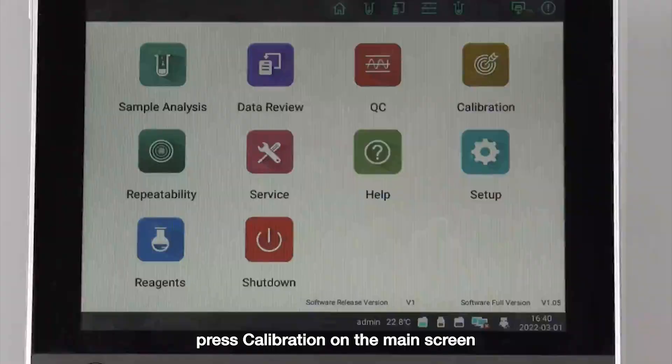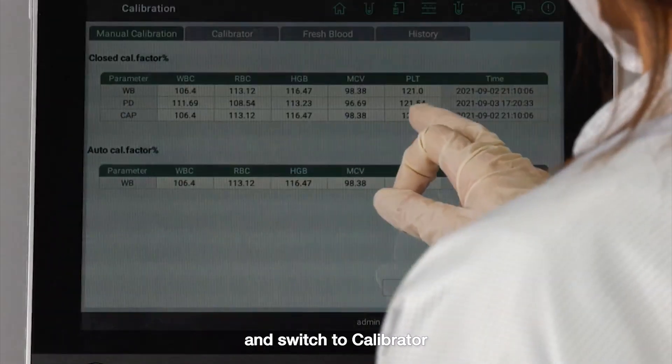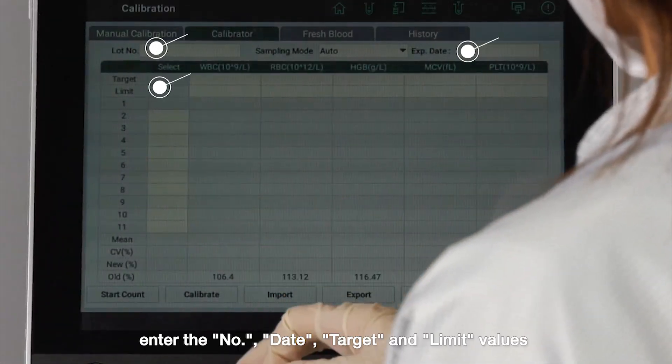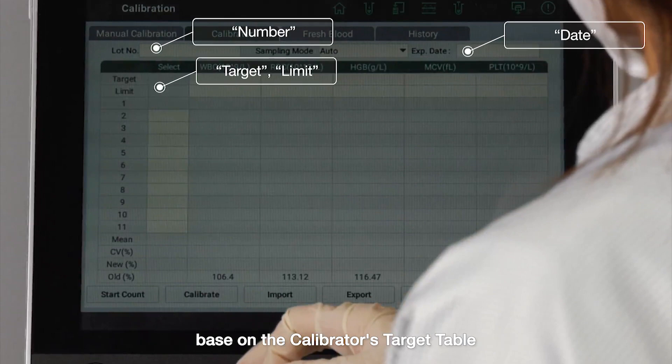Press calibration on the main screen and switch to calibrator. Enter the number, date, target, and limit values based on the calibrator's target table.